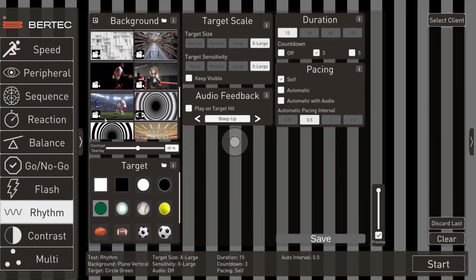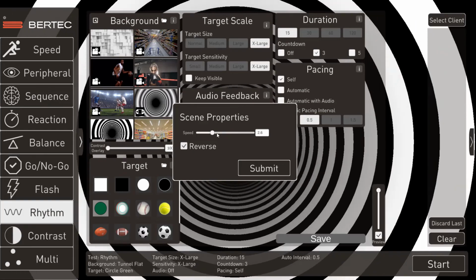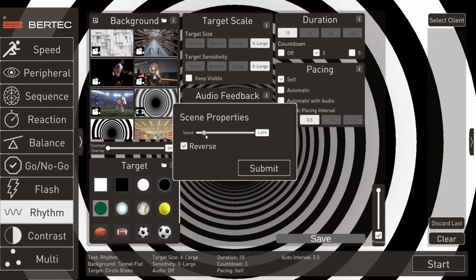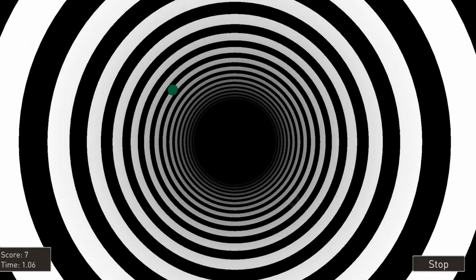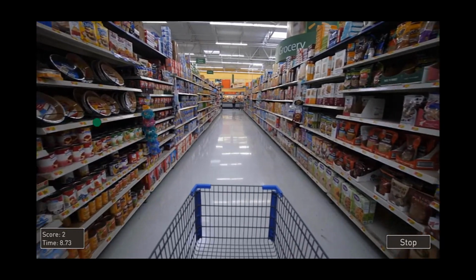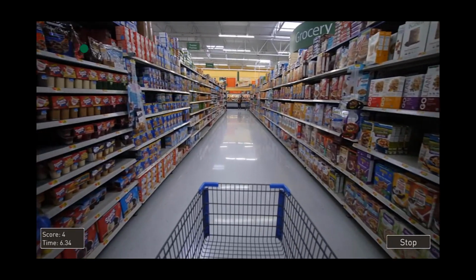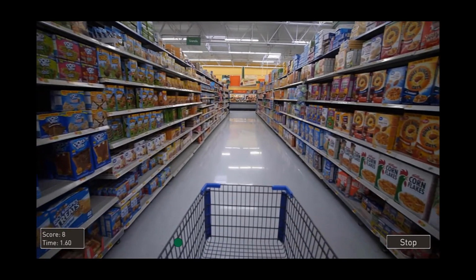When they get good with the vertical stripes, the next progression would be to move to the optic flow circles. This tends to expand the awareness from the center out. And in this case, we're trying to expand it from the center to the left side. This is best accomplished by starting with a slower speed and a higher contrast target if possible. And then, of course, you make it more difficult. The ultimate goal is to be able to move to real world situations and improve their confidence and mobility and reduce their risk of fall.